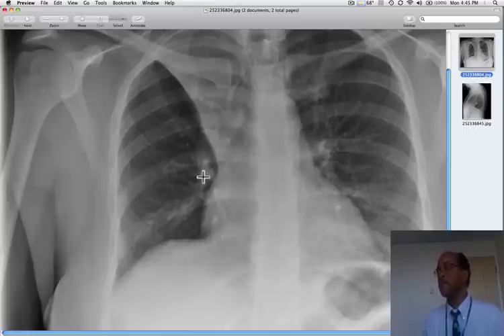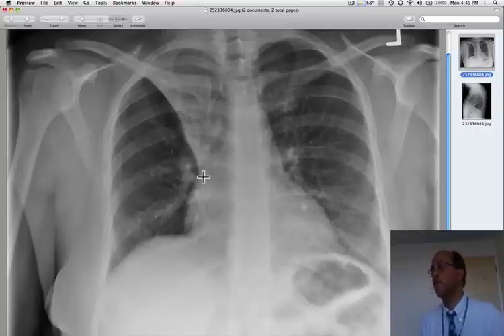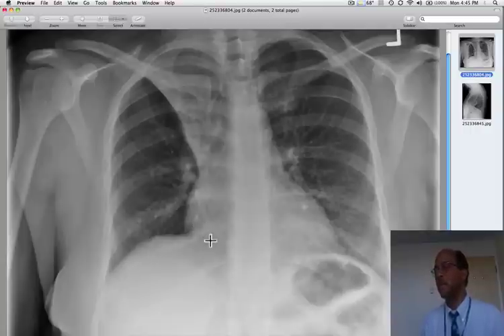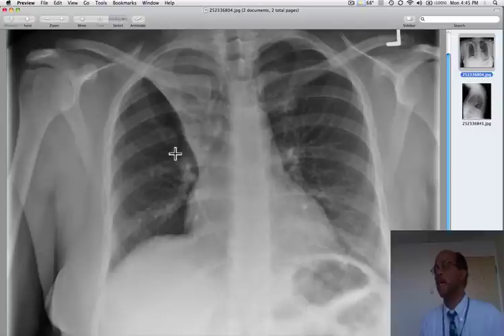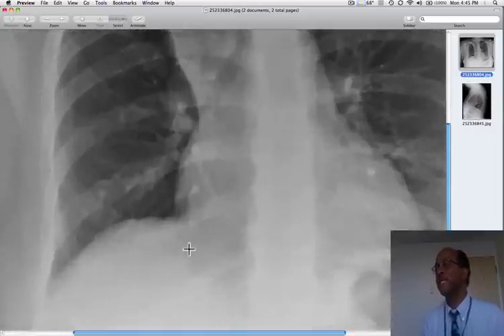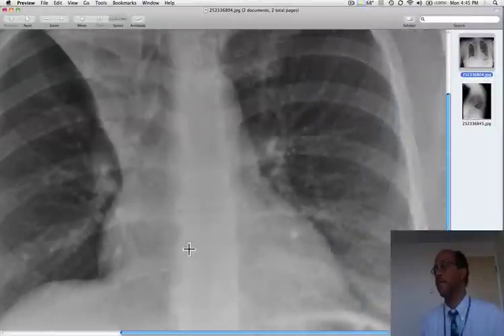Notice also the secondary evidence for lobar collapse. We can see that there's slight distortion — distortion rather than elevation — of the right hemidiaphragm. Additionally, look at the lucency of the right lung. It really is a lot more lucent than the left.